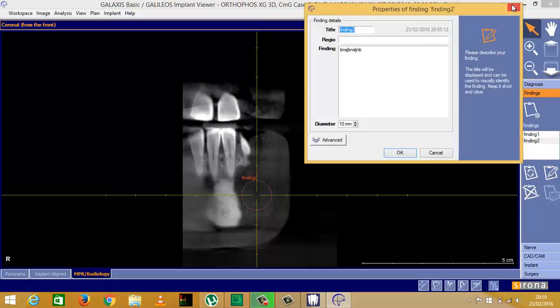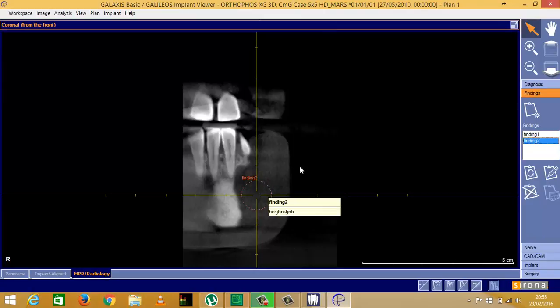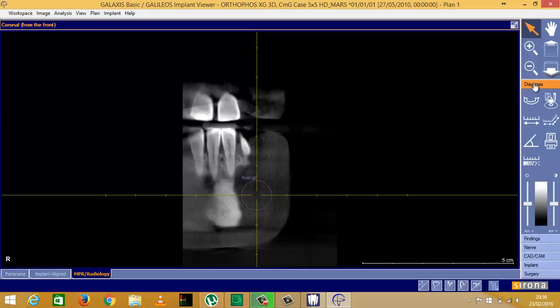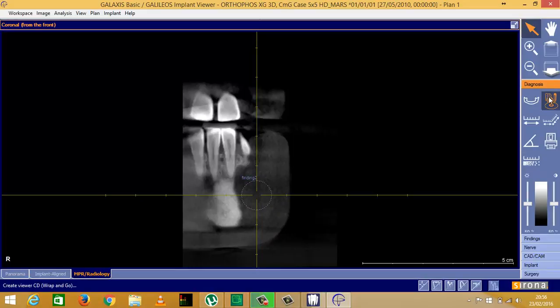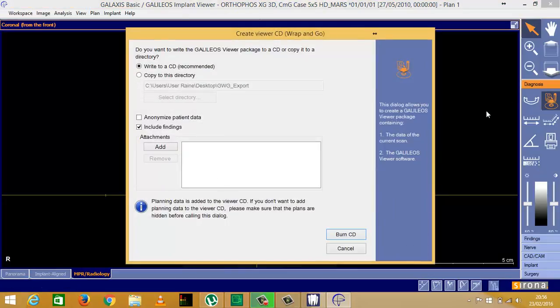Now if I was to send this as a viewing disc to a referring dentist, for example, I can choose to include those findings on that viewing disc. Just to remind you where that is, if I click on diagnosis, and this little icon here that always reminds me of the Starship Enterprise, if I click on that, it will wrap and go.